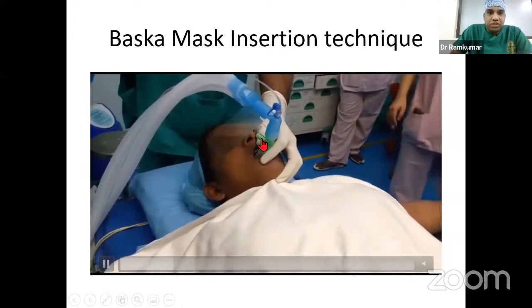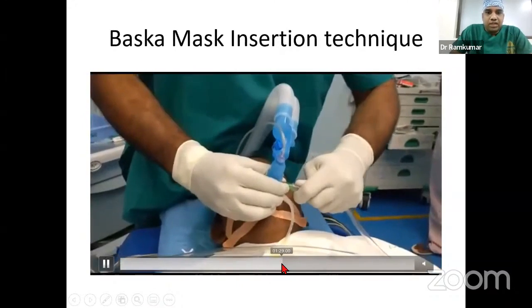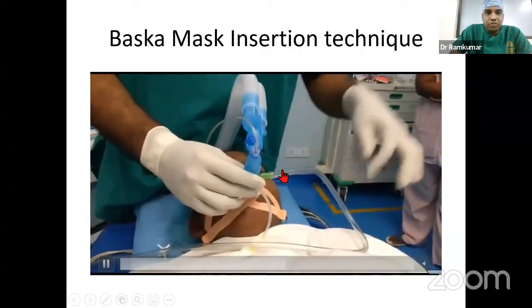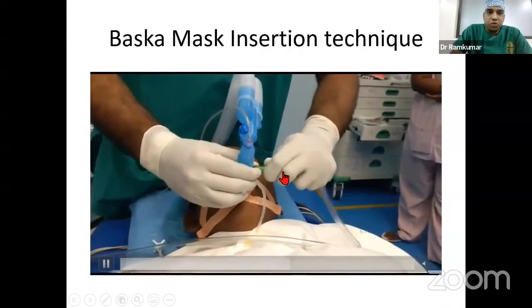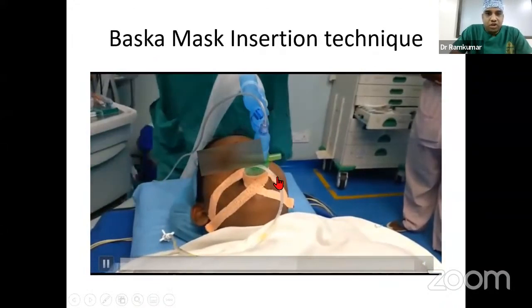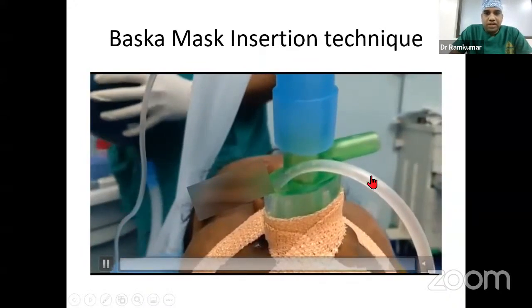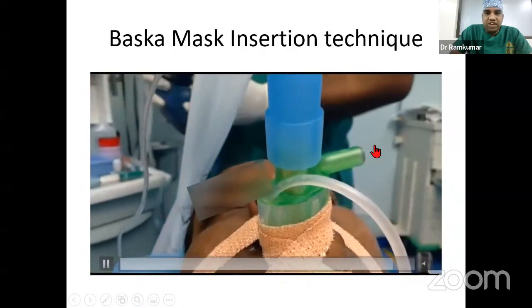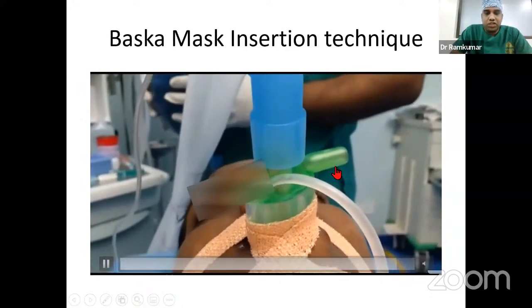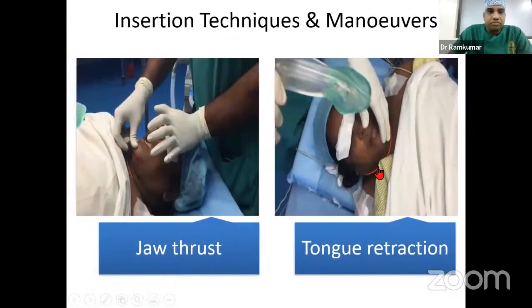And the advantage is you can use this drain, suction elbow on either side. So I'm suctioning the drain tube. This is the only device where I can do a hypopharyngeal suction as well as a gastric suction, and you can pass the Ryle's tube. Already passed the Ryle's tube into it. That's the advantage of the device. There's a Ryle's tube on the other side, and this is kept as a vent. You cannot do suctioning on both sides. One has to be kept as a vent to avoid mucosal injury.